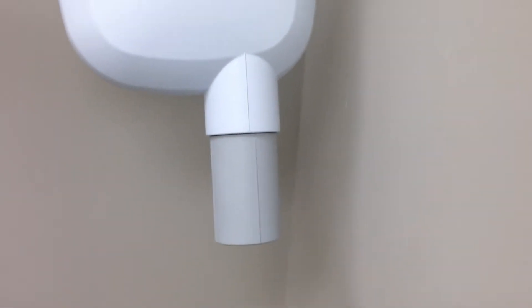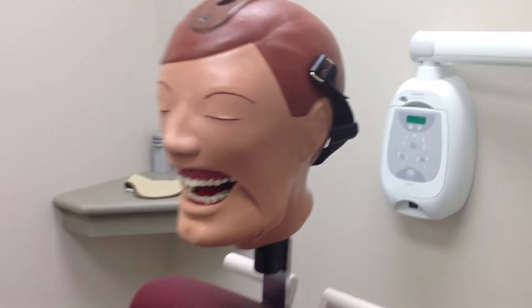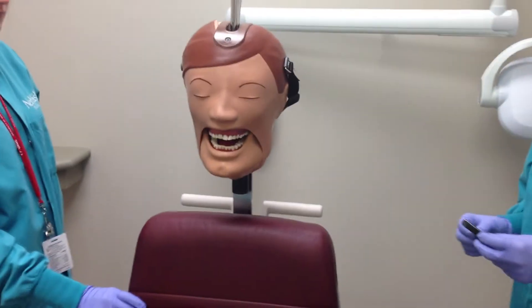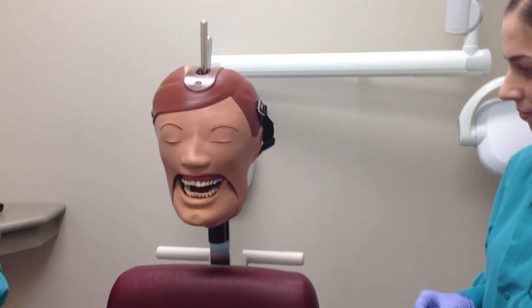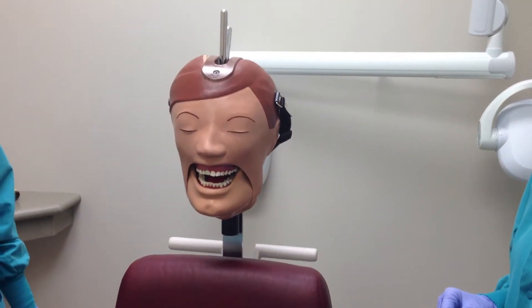Before you begin, make sure you explain the procedure to your patient. Now position the patient upright in the chair and adjust the level of the chair to a comfortable working height. Adjust the headrest to support and position the patient's head. For our maxillary occlusal radiograph, the patient's head needs to be positioned so that the maxillary arch is parallel to the floor.